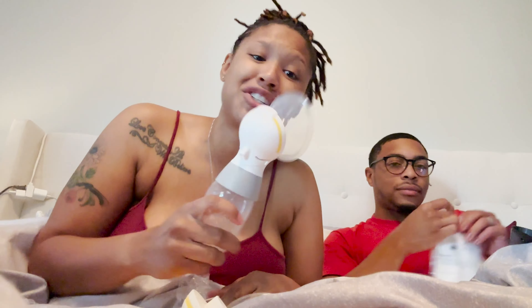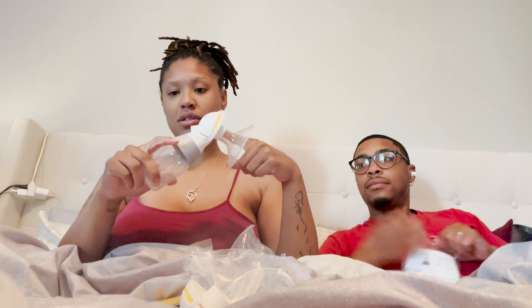Who needs the instructions, y'all? This looks like it hurts, I'm not gonna lie. I'm gonna stop — on the inside I guess that's okay.